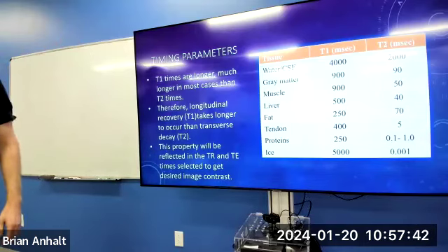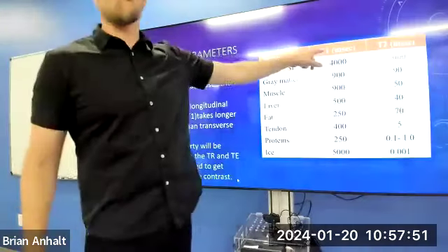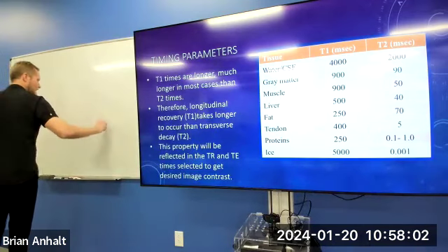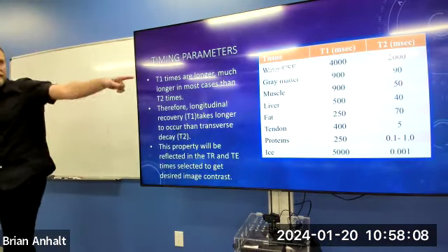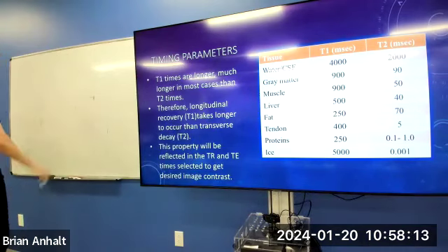When I see 4,000 versus 2,000, 4,000 takes longer. Well, you gotta think about what this is too. This is the T1 time of a tissue, right? So this is the time it takes for water to go from zero, and it's gonna recover over time. That's its longitudinal component regrowing, right? That is the time it takes for 63% to recover from zero.